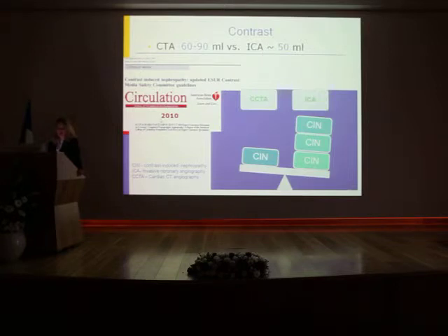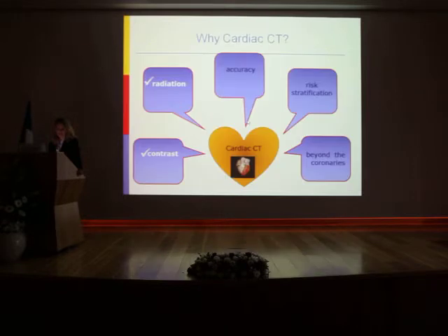However, these two publications, one of them from the ESUR Contrast Media Safety Committee Guideline, state that intravenous injection, like we do in cardiac CT, is significantly less harmful than intra-arterial injection, which is done during invasive coronary angiography. This might be due to the fact that the catheter itself may dislodge some cholesterol emboli, which will go and infiltrate in the kidneys and cause kidney damage. So there's actually almost no report on contrast-induced nephropathy due to coronary CT angiography.